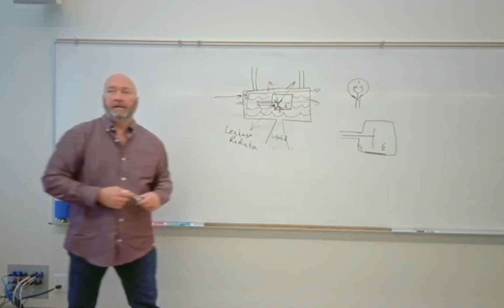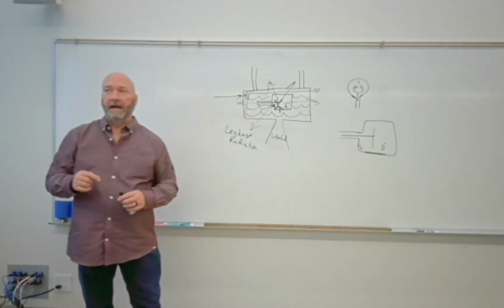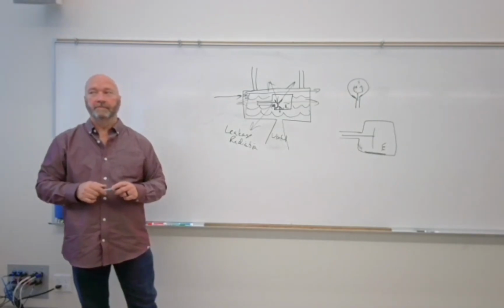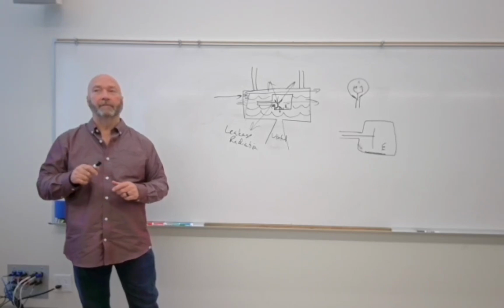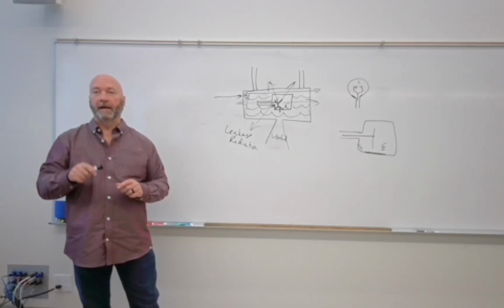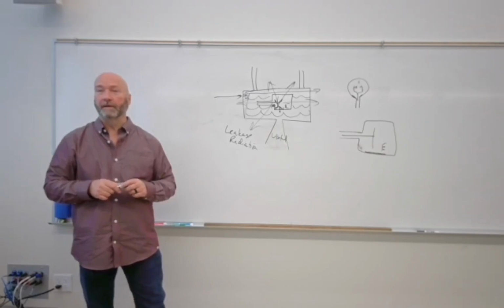Okay? Thinking back to electricity, is glass a good insulator or conductor? Insulator. It's a good insulator. What about metal? Conductor. What about glass that's coated with metal? It's also going to be a conductor, right?